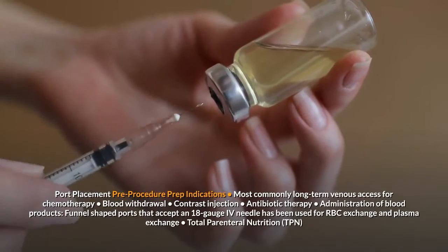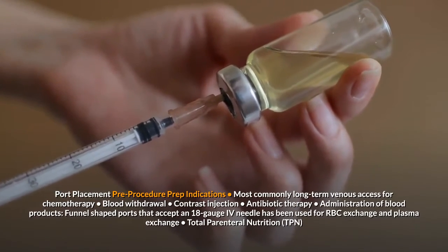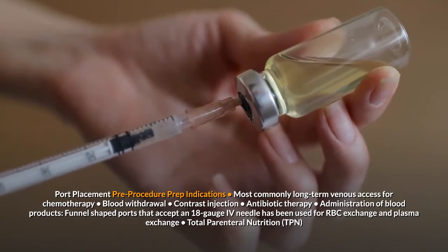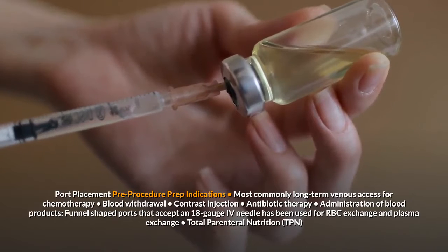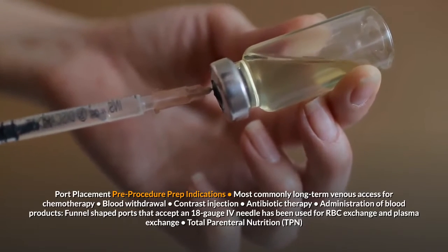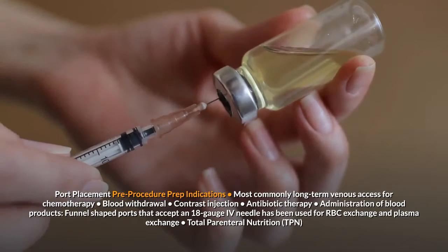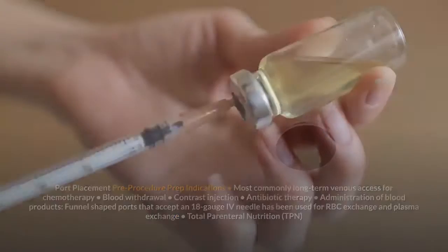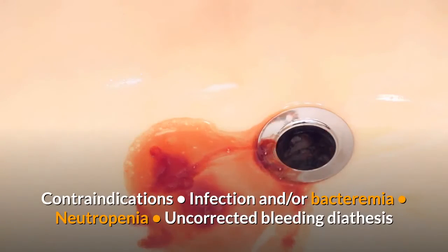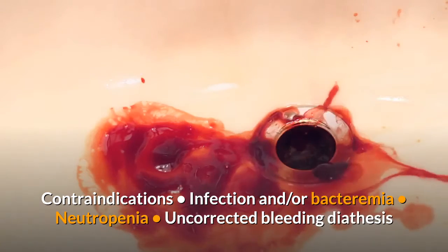Port placement pre-procedure prep. Indications: most commonly long-term venous access for chemotherapy, blood withdrawal, contrast injection, antibiotic therapy, administration of blood products. Funnel-shaped ports that accept an 18-gauge IV needle have been used for RBC exchange and plasma exchange, total parenteral nutrition, TPN. Contraindications: infection and/or bacteremia, neutropenia, uncorrected bleeding diathesis.